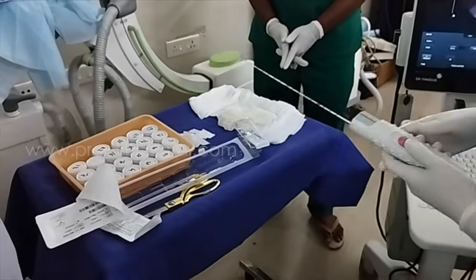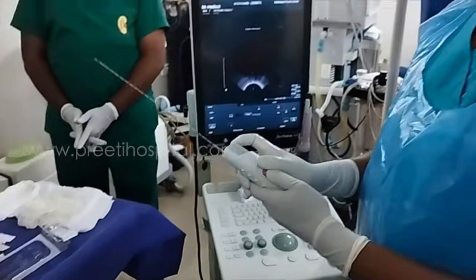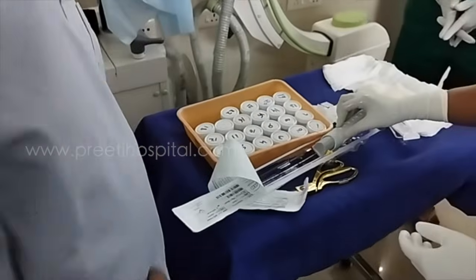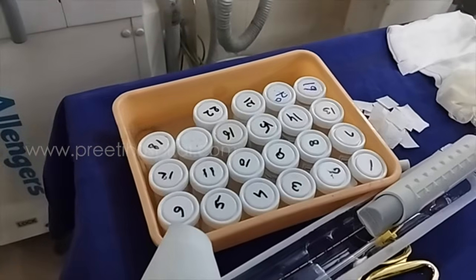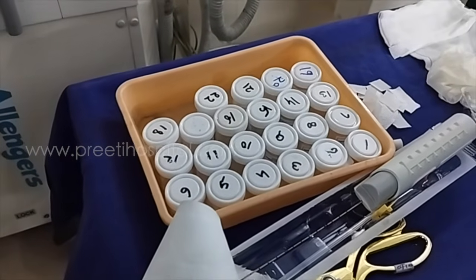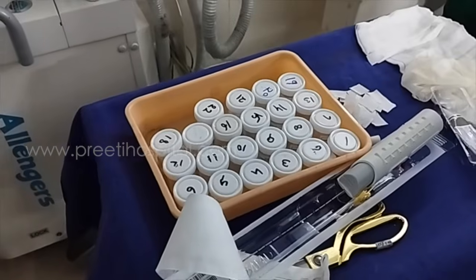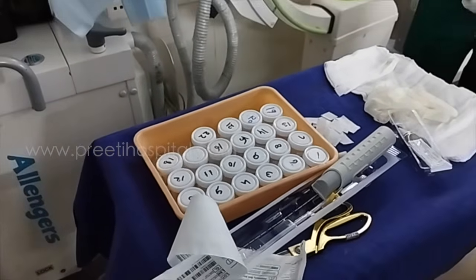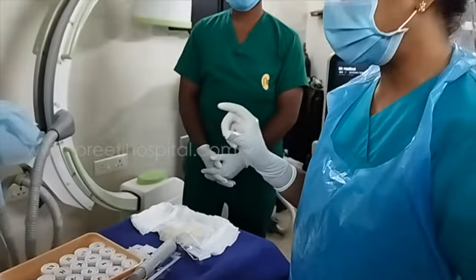Can it be reused or is it disposable? It is disposable, single use. What are these? These are formalin filled bottles. We usually take a 12 core biopsy, but if there is a particular lesion in the MP-MRI, PI-RADS 4 or 5 lesion, we do targeted biopsy with MRI cognitive fusion. So we take an additional 2 to 3 cores in that particular area.